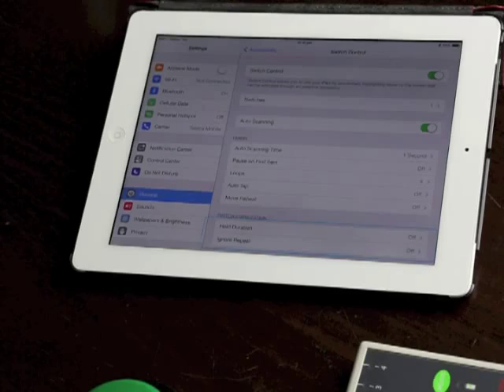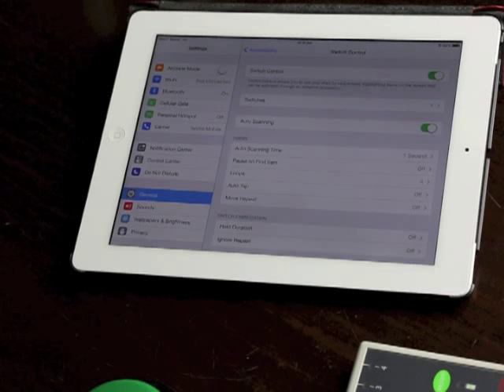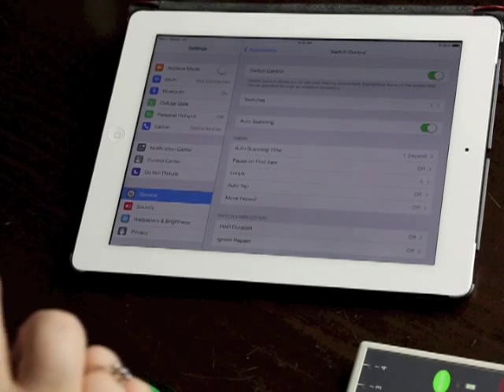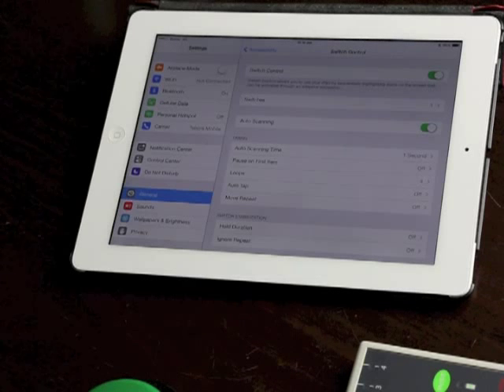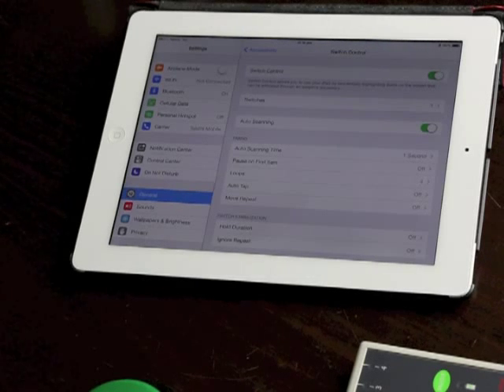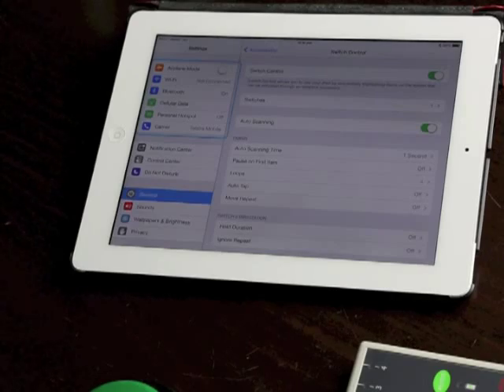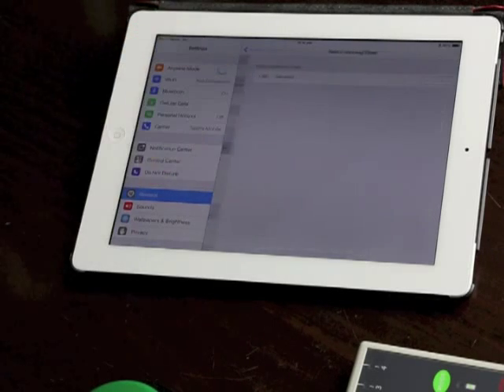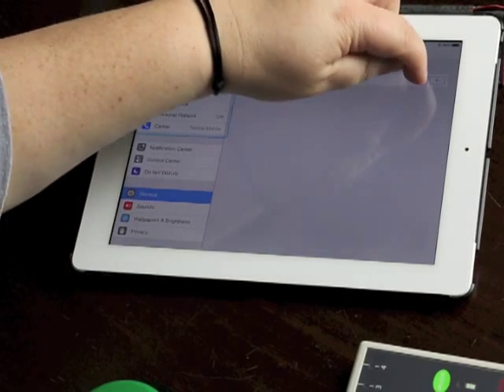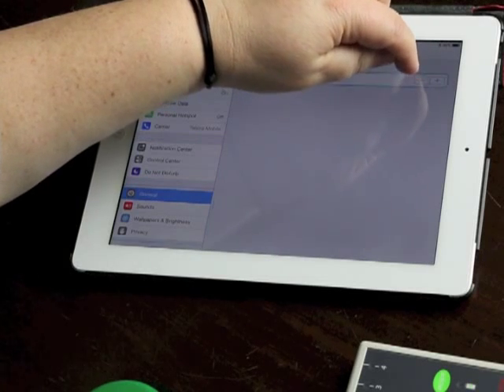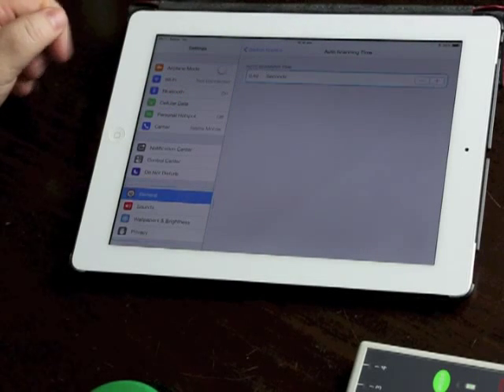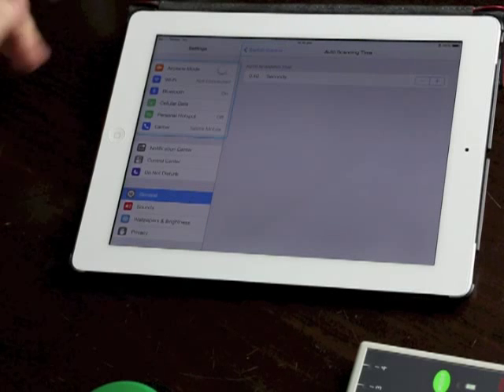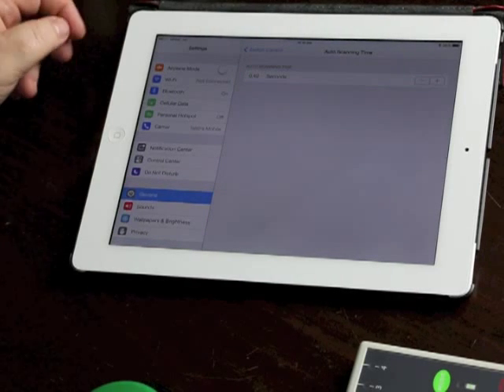There's a group of timing settings next. Auto scanning time is the speed at which that cursor is moving around the screen so I'll just press it to start it again. So the default is one second. If I go in I can make it much faster so let me put it down to say 0.4 seconds and it's moving around far too fast for me at this point but I know some switch users who will love having that really fast speed.